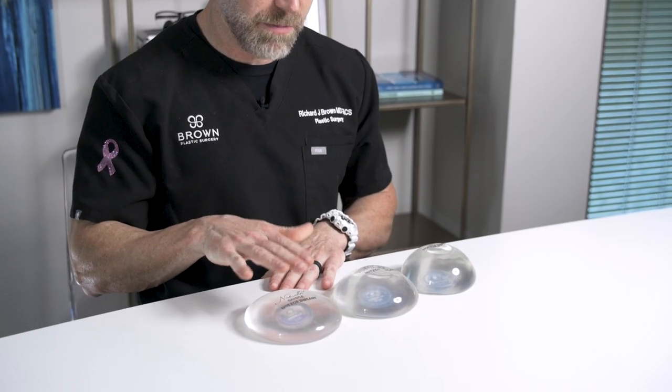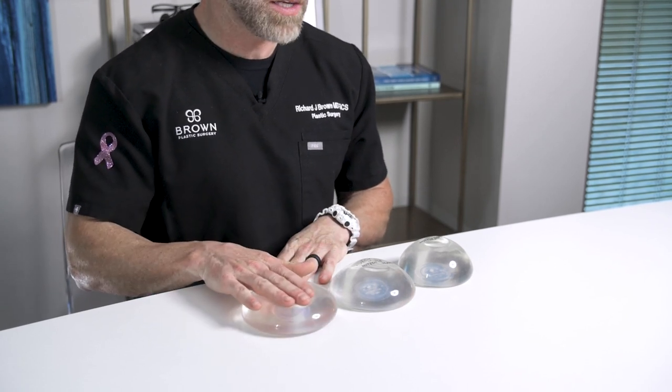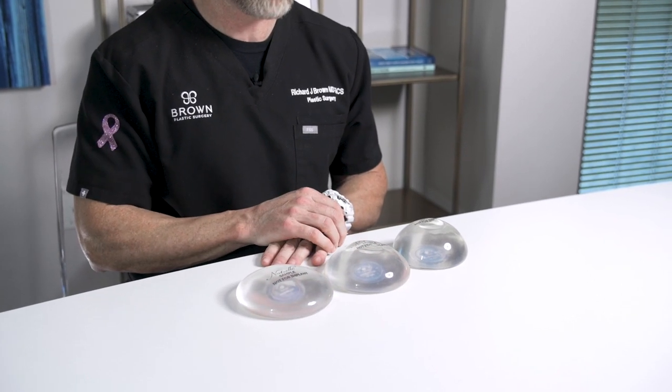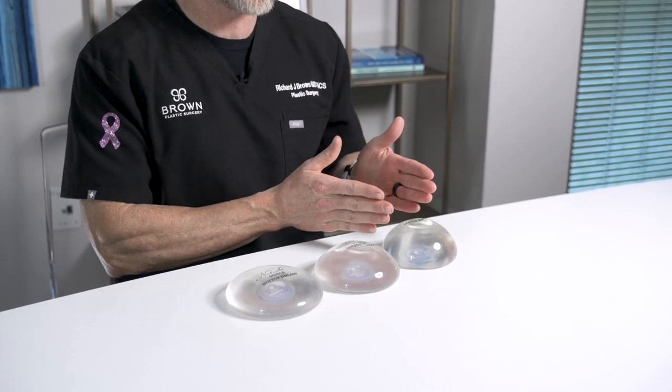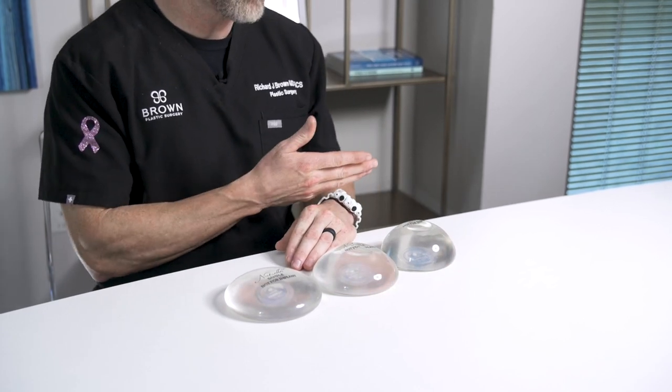The second tool I use to size you is: after I've taken your measurements, we bring in various types of implants — you can see a bunch of them displayed here. This demonstrates the different profiles. There are flatter implants called low profile, a more narrow-base and taller implant is a moderate profile, and even taller and more narrow at the base is a high profile. So how do we determine which one is right for you?